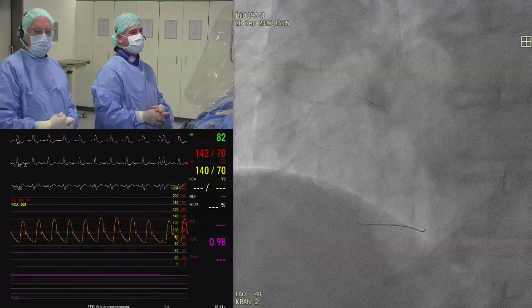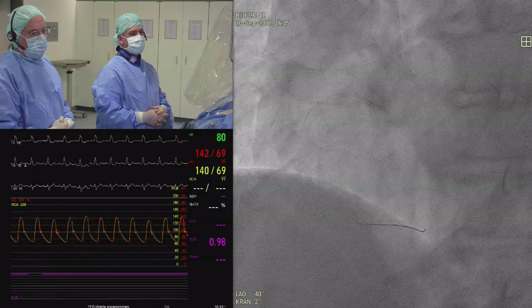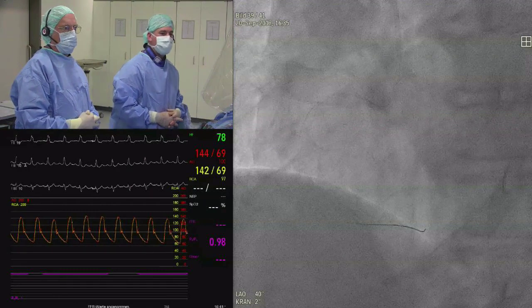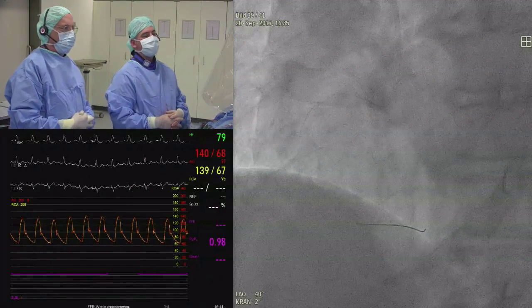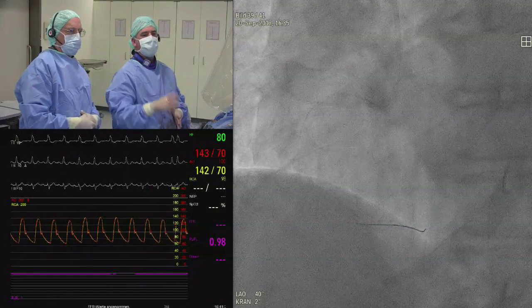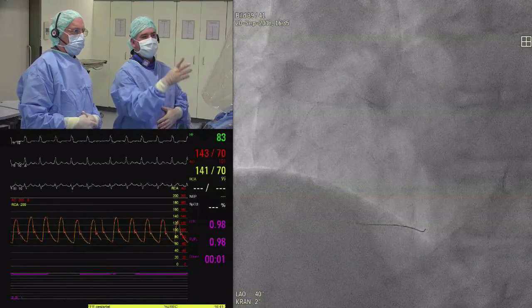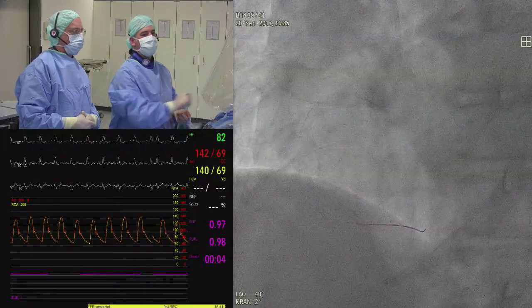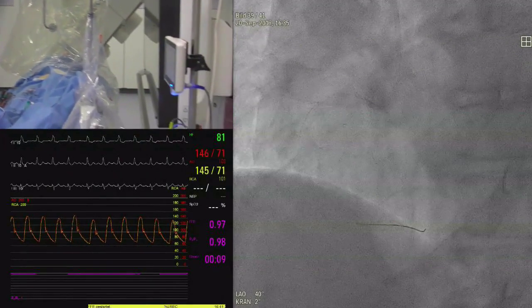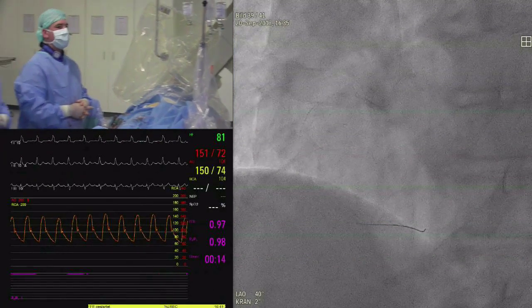So just have a simple question. Do you use the optomonitor, or are the curves coming from your cathlab system? This is from our cathlab system, actually. Oh, nice. Okay. So that one's their monitor, exactly, the small one on the side. We have another small monitor, but this one works very fine for us, and it's the one we use for every FFR, so it's very consistent, and I would like it to be as easy as possible, actually, if you're dealing with physiological measurements. Nice.